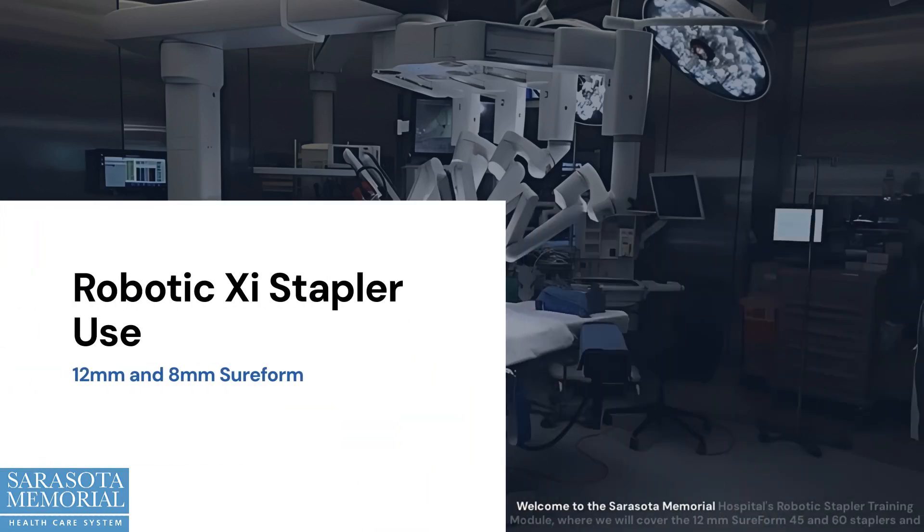Welcome to the Sarasota Memorial Hospital's robotic stapler training module, where we will cover the 12mm SureForm 45 and 60 staplers and the 8mm SureForm stapler. In this module, we will review the available staple loads, how to properly load and unload a staple cartridge, and essential handling techniques to ensure safe and effective use during robotic-assisted surgery.